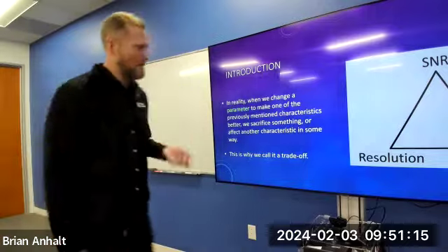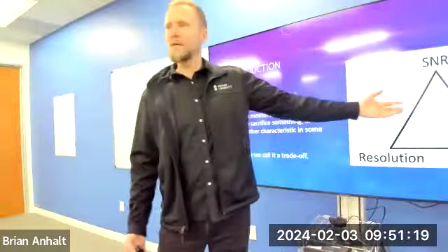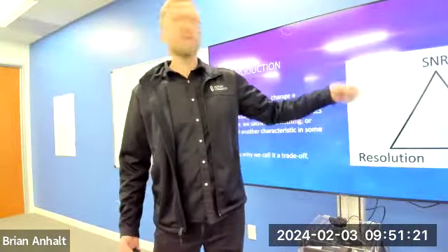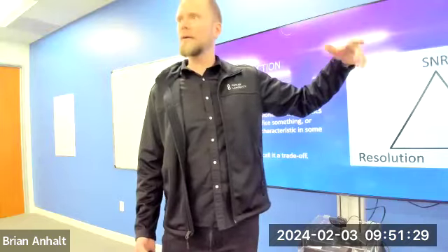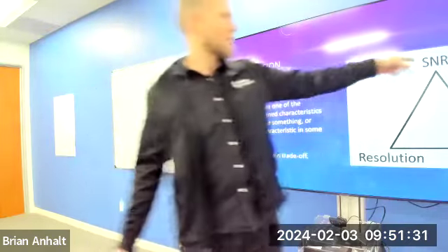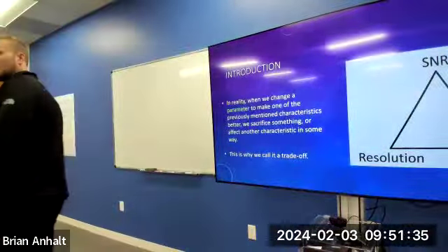And what I would do today, maybe to take notes, is make this triangle and start putting different parameters into these categories. And then say what it does if I lower it or raise it, right? So I might put SNR, put my TE in here. What happens to SNR when I raise my TE or lower it?